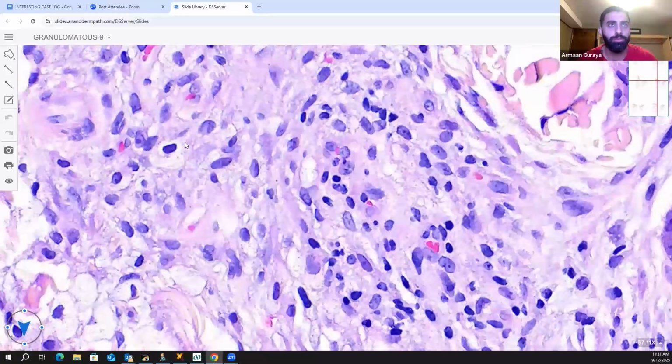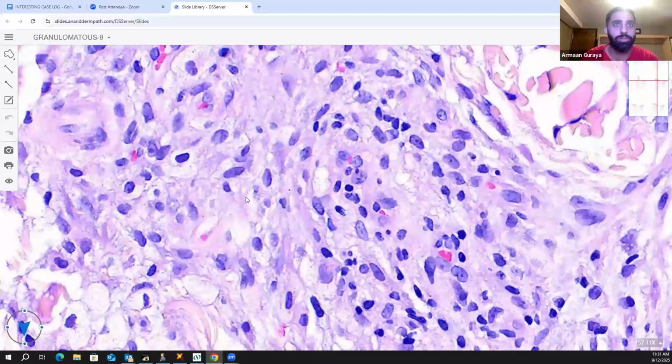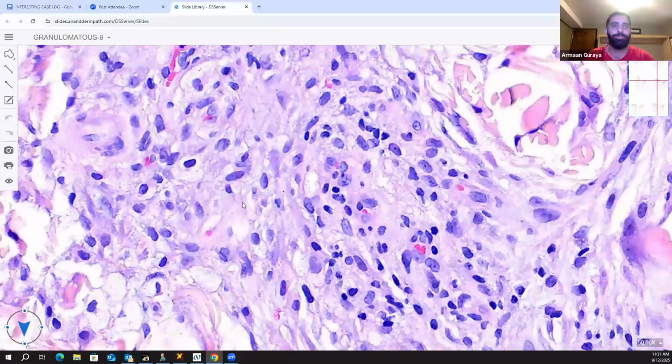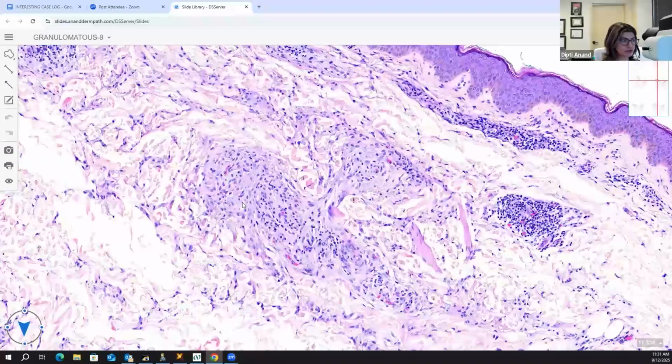Histiocytes. And what do you think they have in them? It's maybe lipid. Exactly, it is lipid. When you think that histiocytes have maybe lipid in them, you're dealing with an eruptive xanthoma. So eruptive xanthoma is like the primitive form, right? Your triglyceride levels go up and the patient erupts. So these are the least well-formed xanthomas.